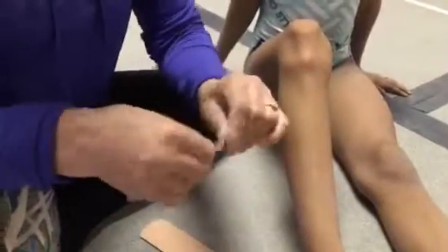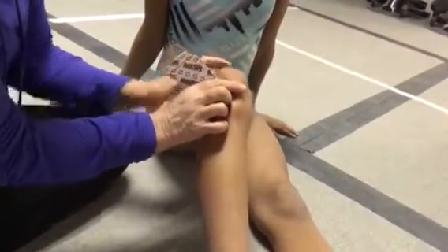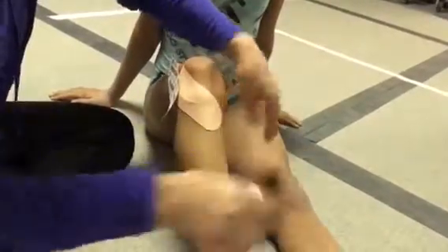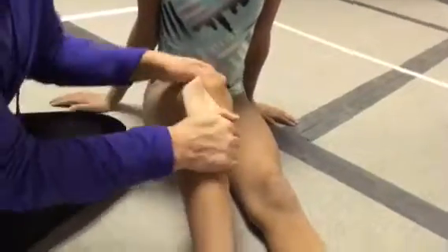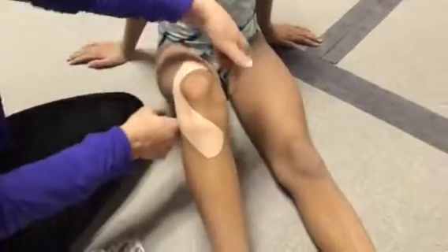You start like this and rip it like that, then place it right on the side of the kneecap. Without stretching the tape out, put it right over that bump and right around the kneecap like that, then smooth it out. Notice that I have her knee bent about 35 degrees.